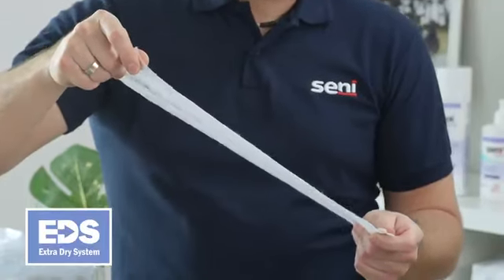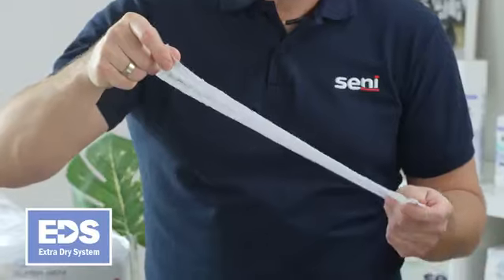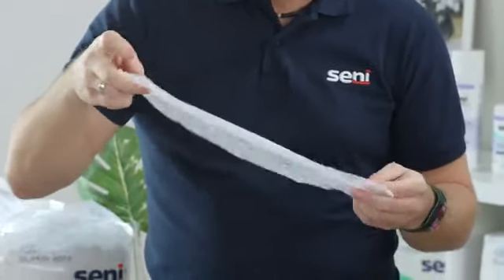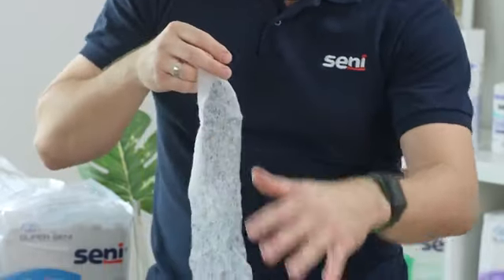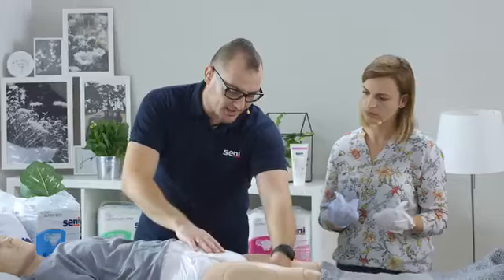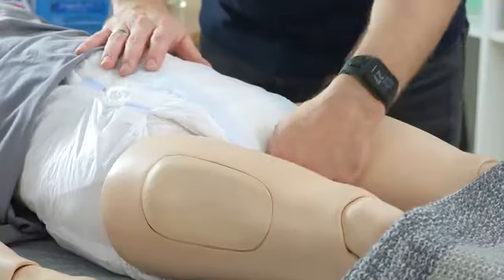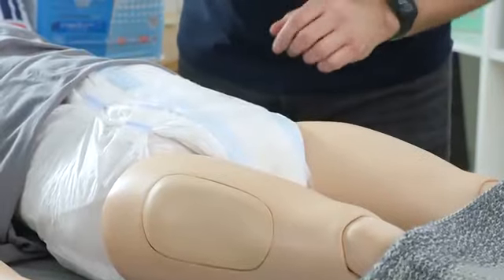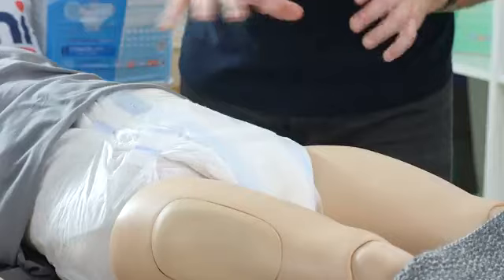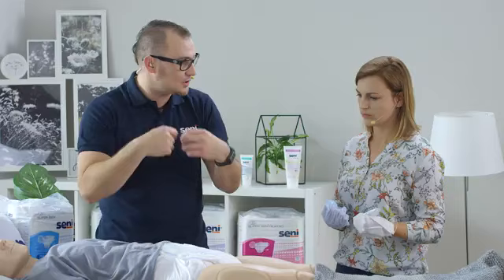It is the extra dry system, that is, a system for additional dryness. This is a special distribution system that helps you make the most of your absorbent core in the product. Of course, it is located on the inner side of the product. And let's remember that the urethra in women ends more or less in this area. In men, it depends on penile position, but urine is always excreted in a single place.